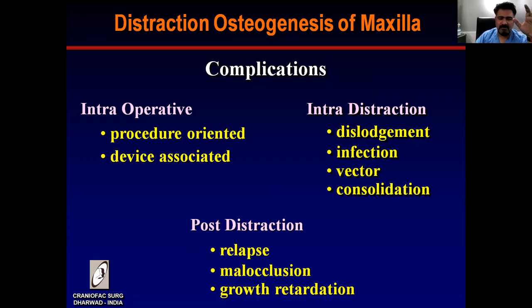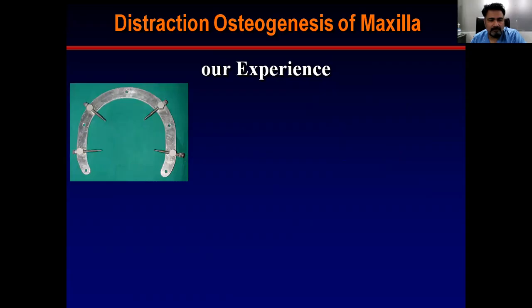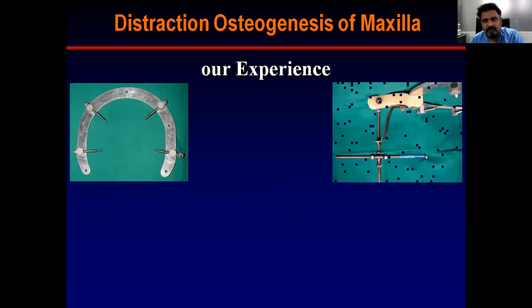Post-distraction relapse is the major complication, then malocclusion and sometimes growth retardation. These are the external appliances which we have used in our time.